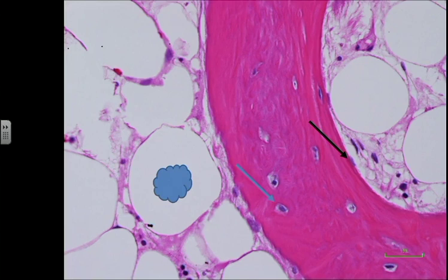Okay, to summarize, this is an image of bone from an adult. Clues that it's an adult: I have fat cells in the bone marrow, not hematopoietic cells, and we can see this with the white globules. I can see the bone doesn't have any osteoblasts, none of the bigger cells that were next to the bone, as we saw in the image of a child. Instead, we have these flat cells that we call bone surface or bone lining cells.